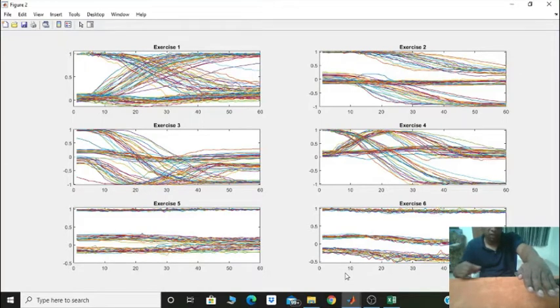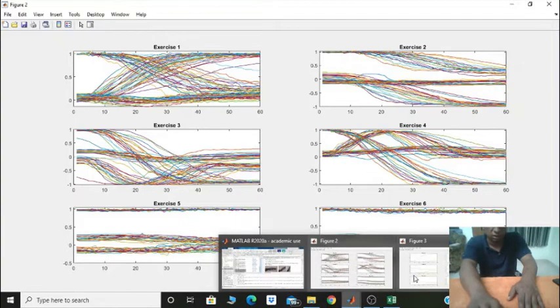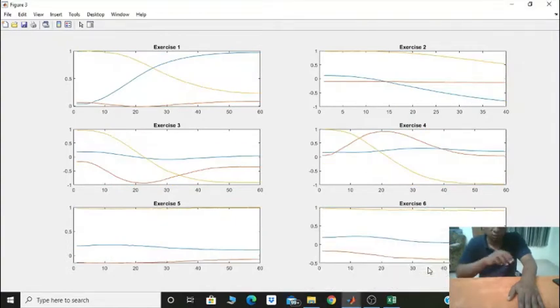We have carried out multiple such exercises, and the results that we have got from this are plotted in the graph that you can see here. However, there were some variations, so we have taken an average of all those readings and taken that as the mean of the responses. So this will be how the waveforms should look for each of these exercises. And as you can see, each of these exercises exhibit different waveforms.